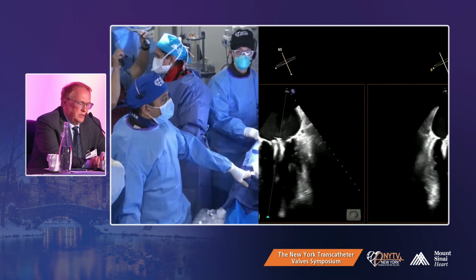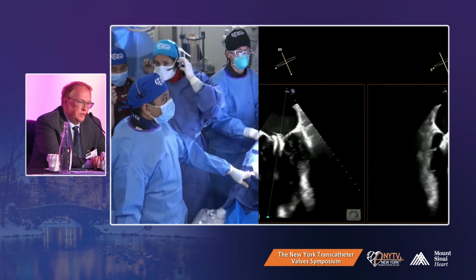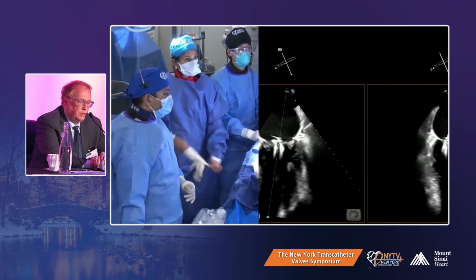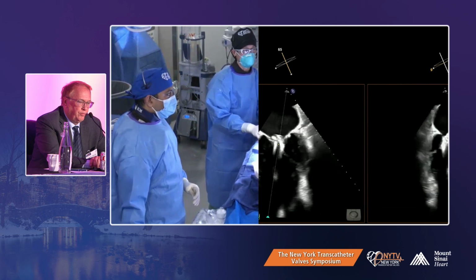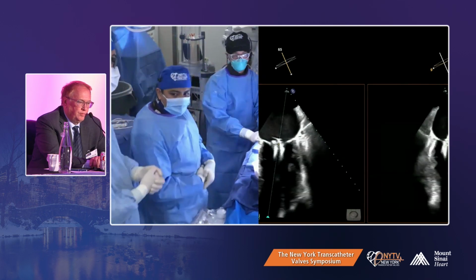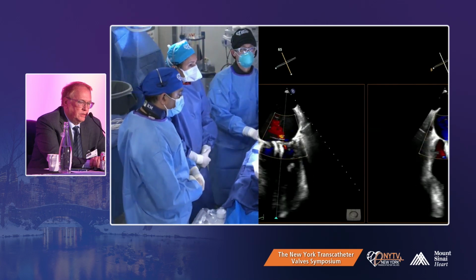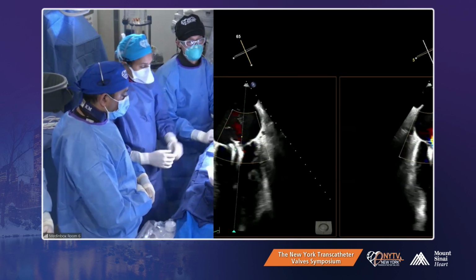We still had to do independent grasping because, even with a quarter turn plus, it was challenging to get enough anterior leaflet. So we did anterior leaflet and scoop to get the posterior leaflet. We deployed that, and we have a lateral residual jet. Now we're ready to deploy the XT, lateral to the first clip. The first one was XTW, the second one was XT. Once we got our transseptal right, it was just a matter of 10 minutes to do both the clips. That's beautiful. This is a very good teaching lesson.